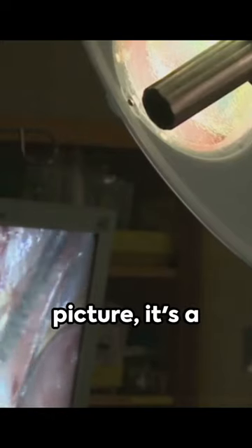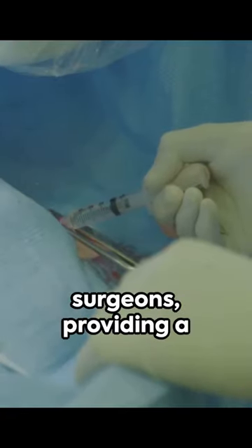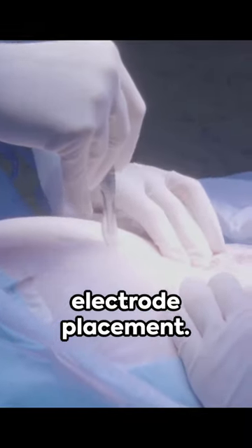This is more than a mere picture, it's a state-of-the-art navigational tool for our high-tech robotic surgeons providing a beacon for safer, pinpoint-accurate electrode placement.